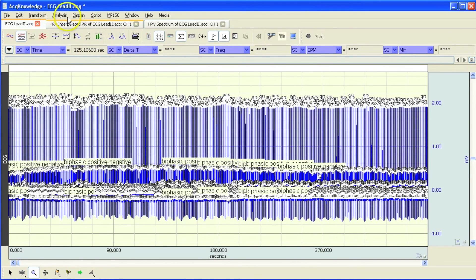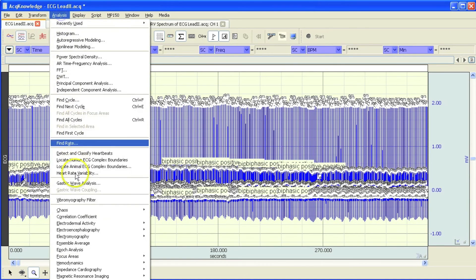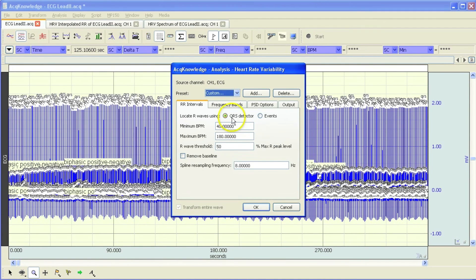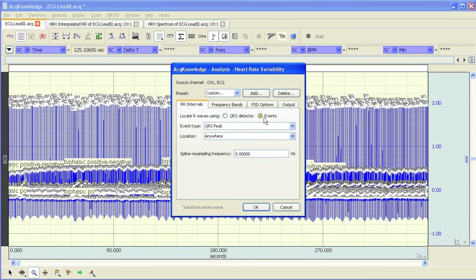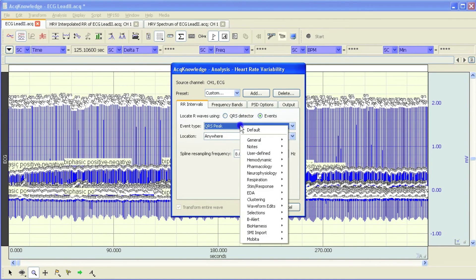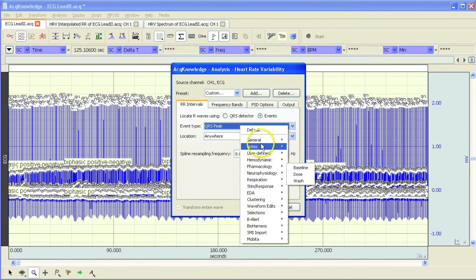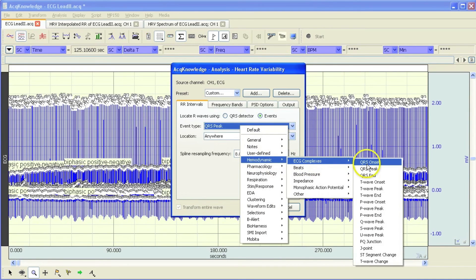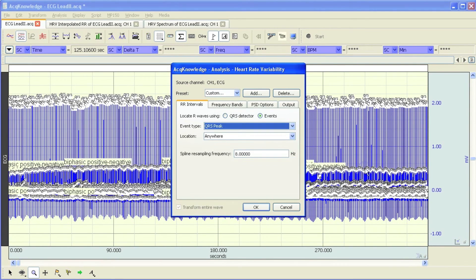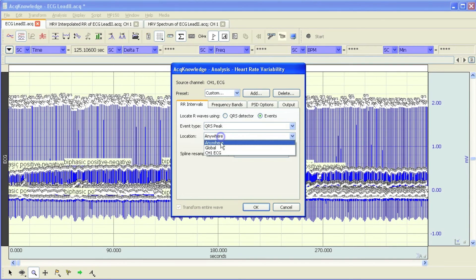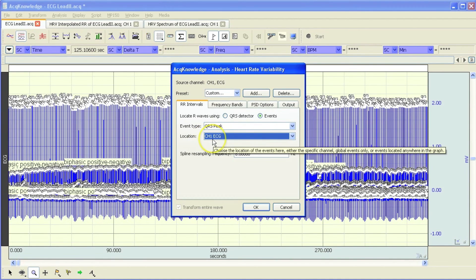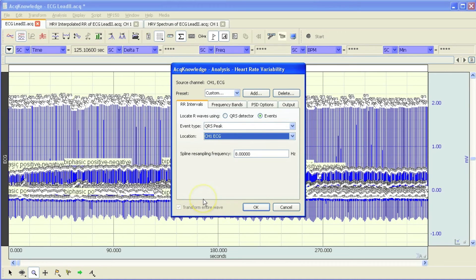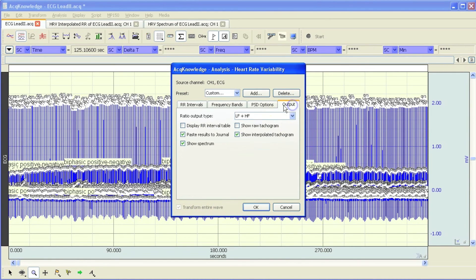Now when we go into the analysis dialog, we can select this option to use events. And we can use any events that are created. It just so happens that this one is set to QRS peak. And they're located in channel 1 ECG. And I'm going to leave my output settings as they were. Hit OK.